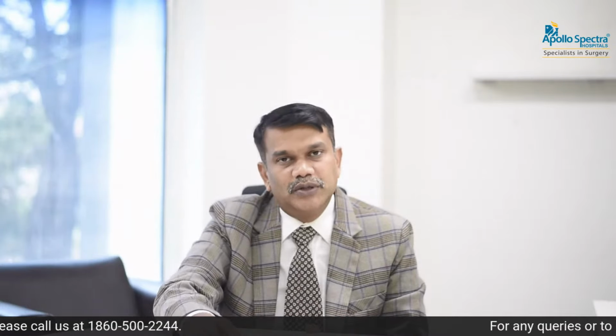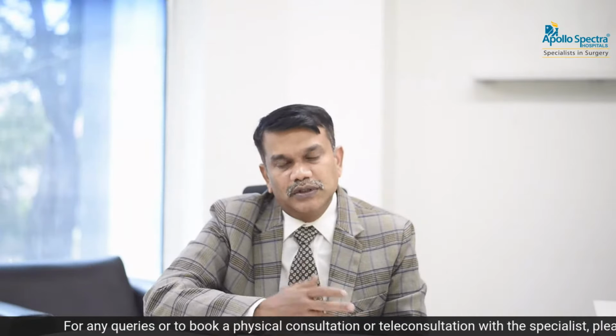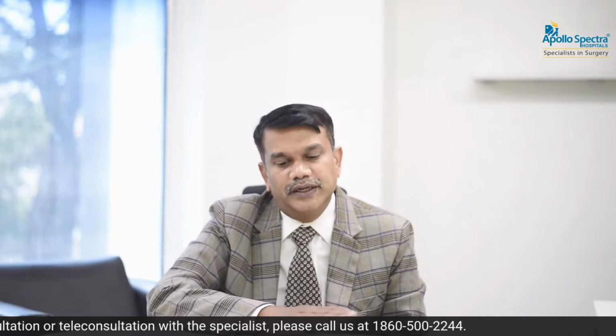Why IPOM plus? From IPOM to IPOM plus. IPOM plus means closure of the defect and placing a mesh over the defect. The mesh has to cover all around for more than 5 cm from the defect. So it will give good strength to the hernia repair.